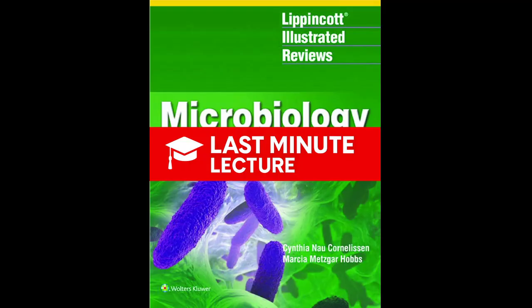And for really slow growers like tuberculosis, which can take 6 weeks to culture, PCR gives you an answer the same day. And it still works even if the patient is already on antibiotics. Yes, because the antibiotics might kill the bacteria, but the DNA evidence is still left behind at the crime scene. PCR can still find it. It's a game changer.